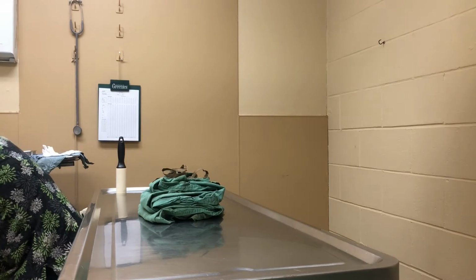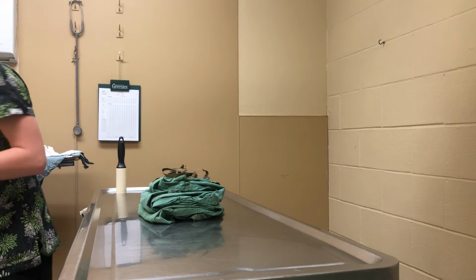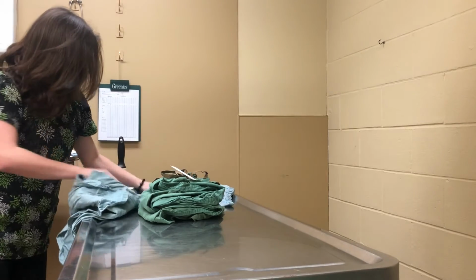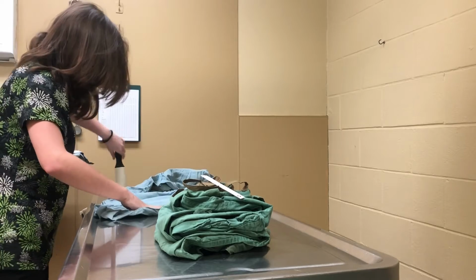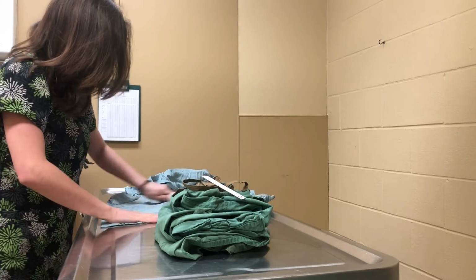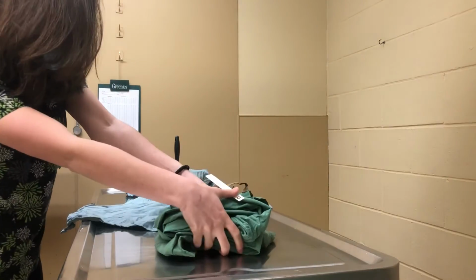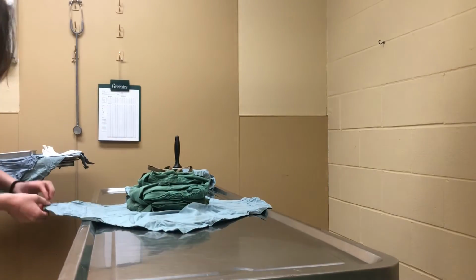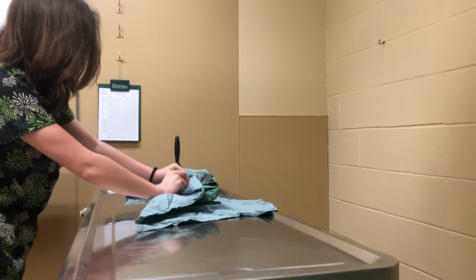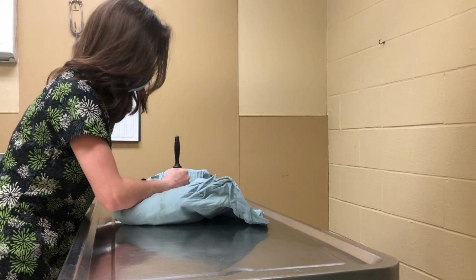Next I'm going to get my indicator strip, and this is just to make sure that the inside of the pack becomes sterile once it's through the autoclave, so I'm going to put that right on top. And I have my 2 gown wraps. So first one, I'm just going to go over it again with the lint roller. And I'm going to put it like a diamond and put my gown in the middle. I'll take one corner, bring it over, pull everything tight, and then I'm going to fold it back so it makes a triangle and sort of do an accordion like that. I'm going to pull everything tight again and do the same thing for the other 3 corners as well.